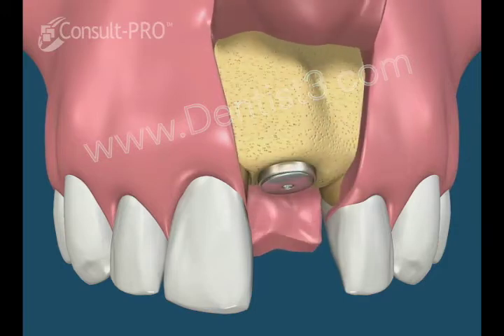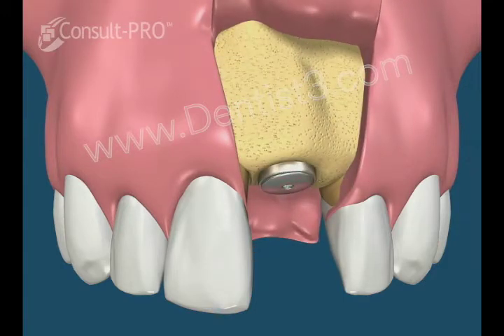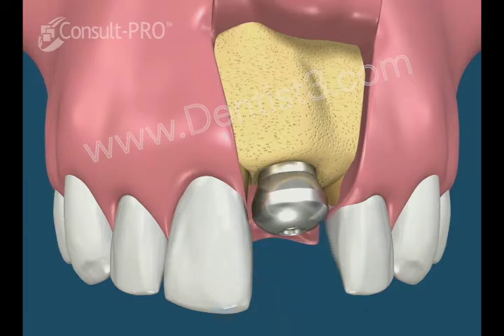At this time the gums are once again retracted and the cover screw is replaced with a healing cap. The healing cap helps the gums heal and allows access to the implant fixture for restoration.